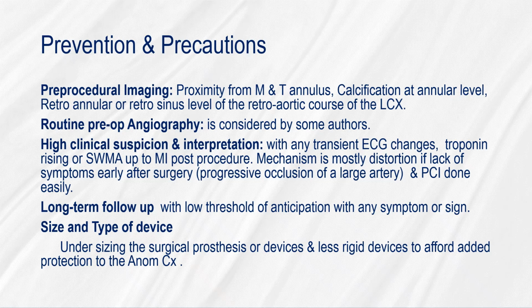Mechanism is mostly distortion if lack of symptoms early after surgery, progressive occlusion of a large artery, and PCI done easily. Long-term follow-up with low threshold of anticipation with any symptoms or signs. Undersizing or using less rigid devices is important to afford added protection to the anomalous CX.